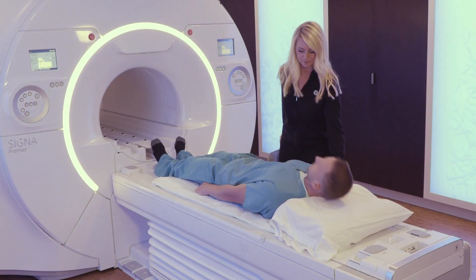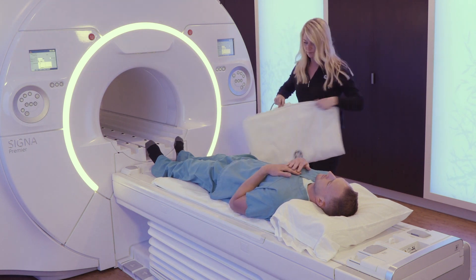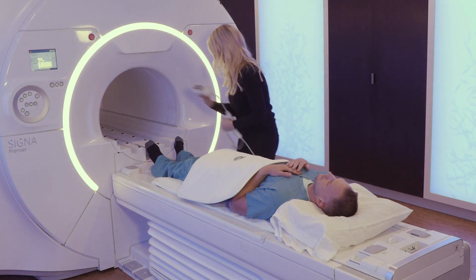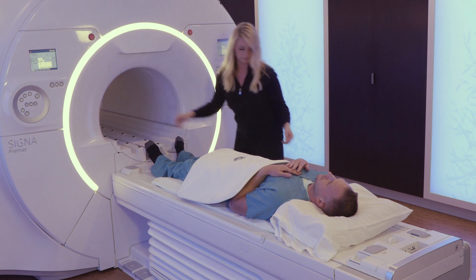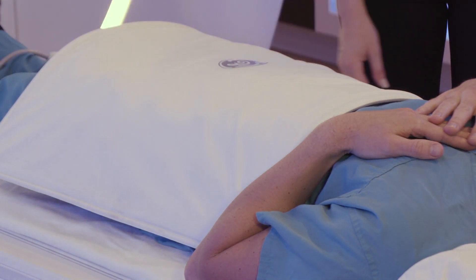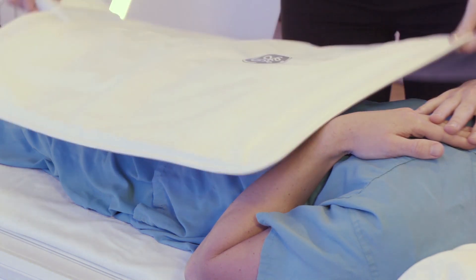To set up a patient for a bilateral hip exam, simply place the Air Technology AA Coil over the pelvic region in a 90 degree rotation. It can also be set up in a zero degree rotation as well.